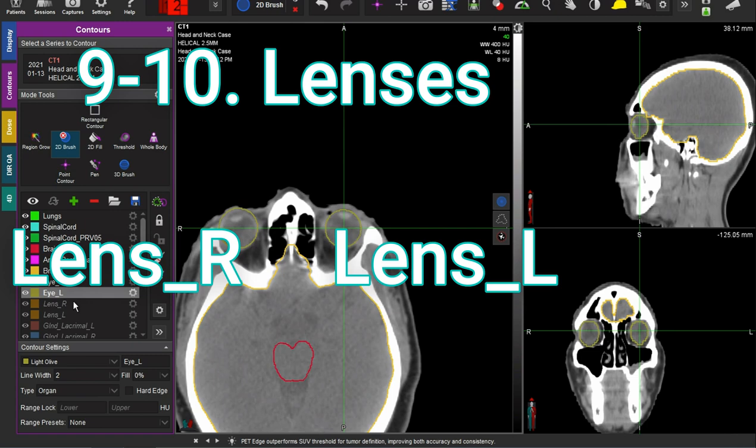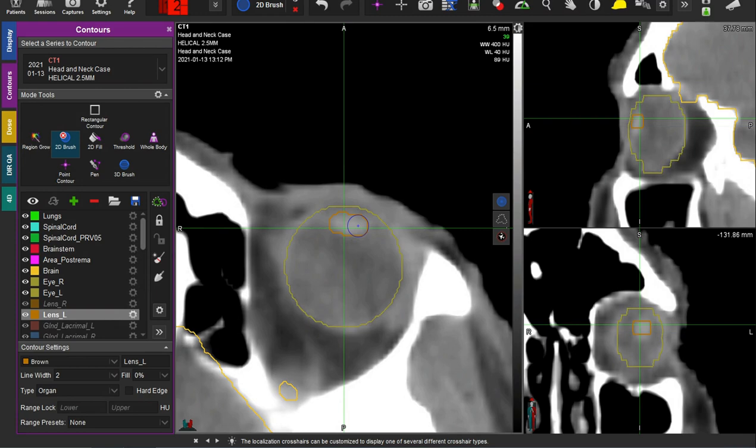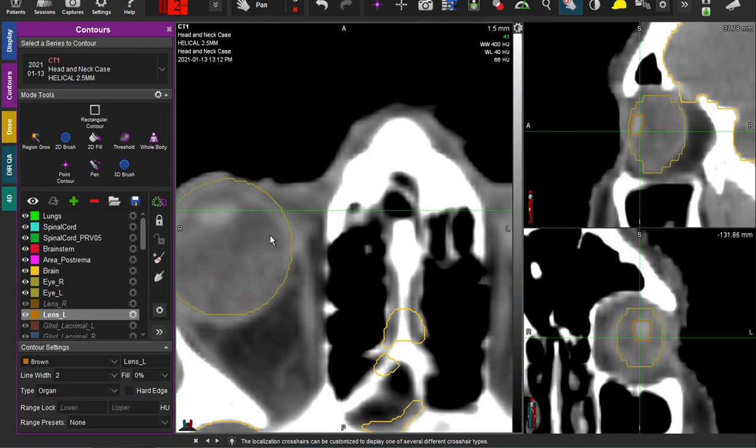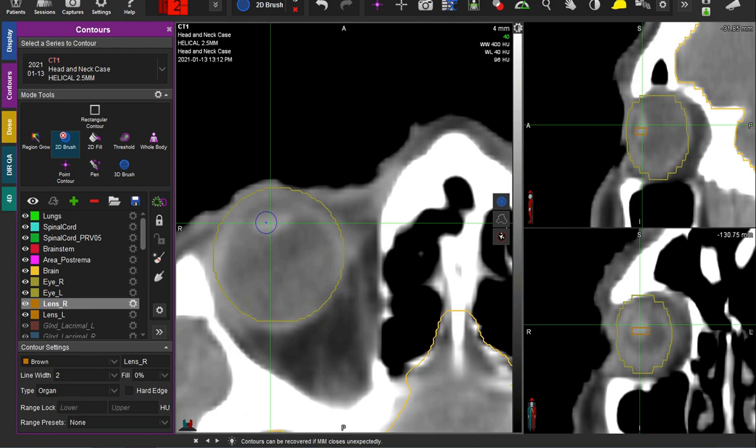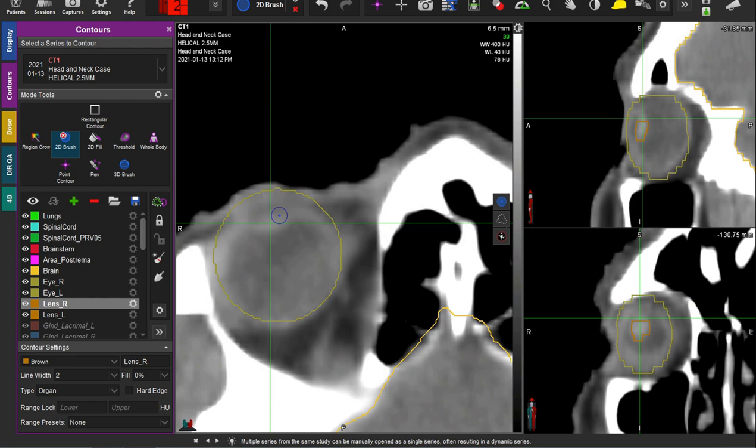Now we're going to do the lenses. The lenses are pretty easy to see — they're opaque, kind of look like bright little spots, usually two or three slices thick. This CT scan uses 2.5 millimeter slices; three millimeters is pretty standard. When we're doing these head and neck regions, thin slice CTs are helpful for making sure we're not missing any important parts of the anatomy.